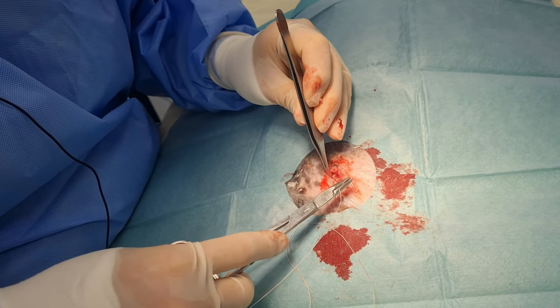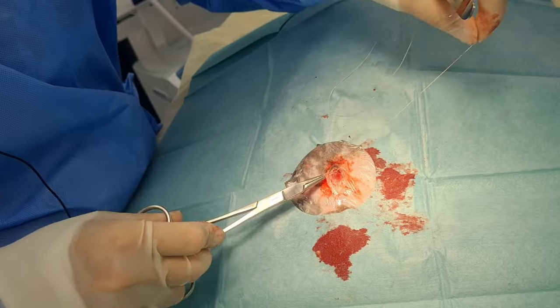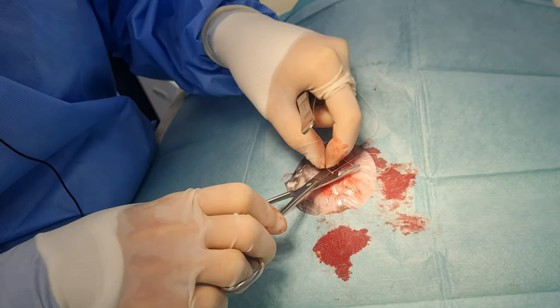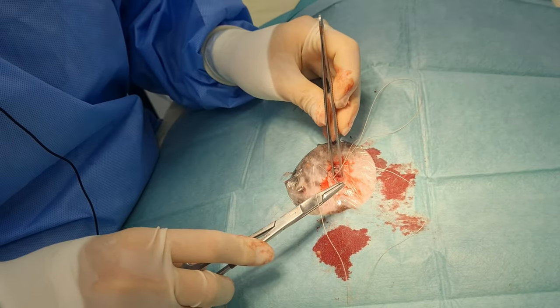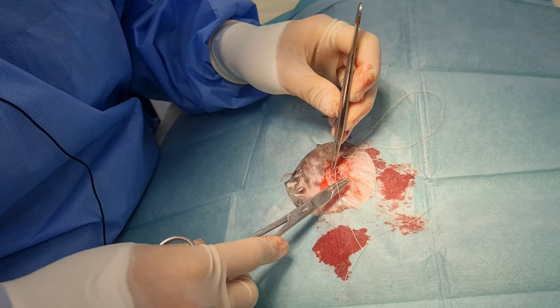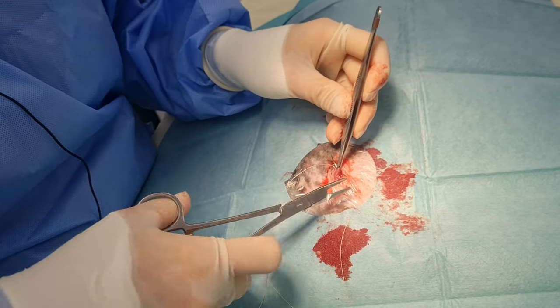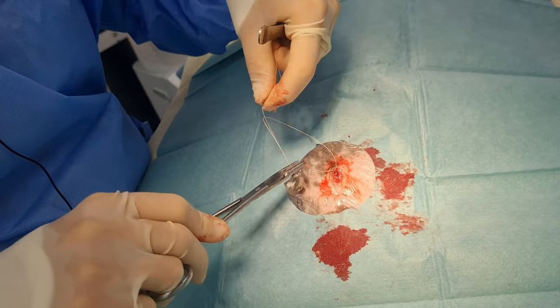Now we've just got a routine closure. We're going to close our muscle layer first. I would use the tunic inversion modification with a sexually mature guinea pig or a sexually mature chinchilla. The two cases where I've seen herniation were both adult animals. If they were only 12 weeks old, which is when I'd be happy to do boy guinea pigs, I probably wouldn't do the extra step — it's a slightly more traumatic procedure and we want to minimise handling.